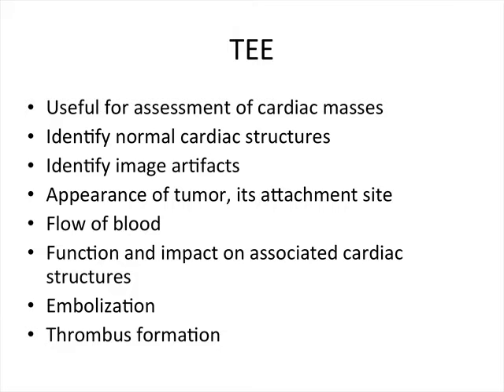After resection of cardiac tumors, TEE is vital for evaluating the integrity of the normal cardiac structures that remain, such as interrogating the interatrial septum for lacerations left after the resection is completed.